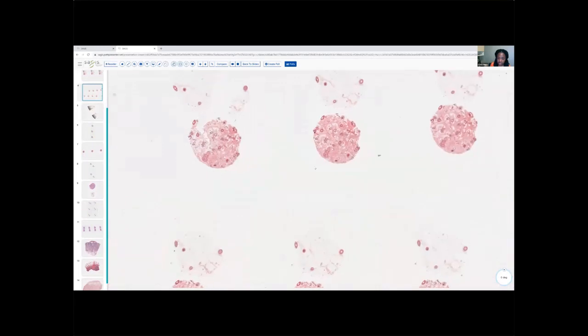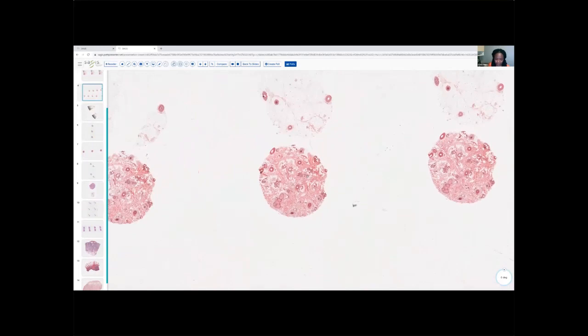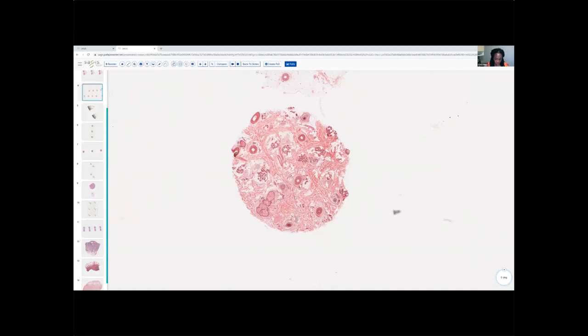This is another example of androgenetic alopecia. So I'll put that out there up front. Same diagnosis, androgenetic alopecia. But what's important here, now we've switched over from looking at a vertical section to seeing a horizontal or transverse section. And remember, we talked about the fact that one of the important things we want to understand when we're looking at horizontal transverse sections is what level of the skin we're looking at. So how do we know that? Well, let's take a look.